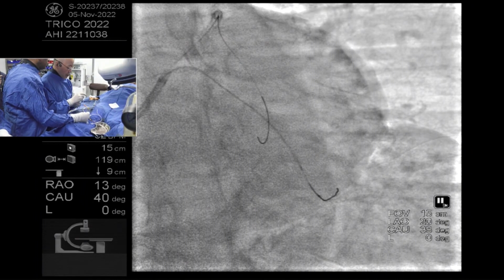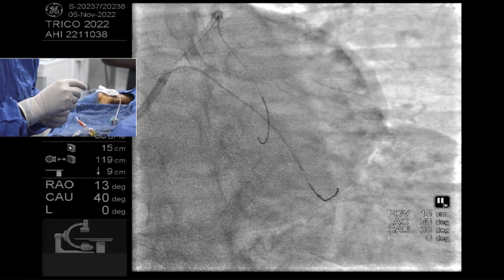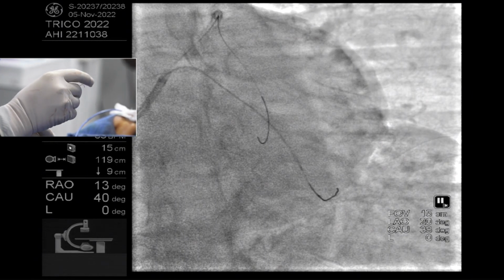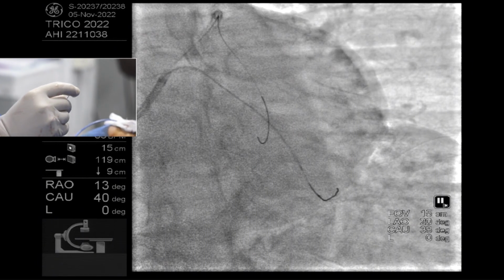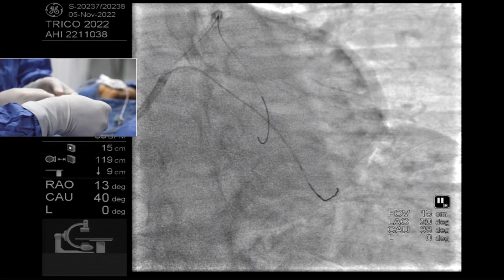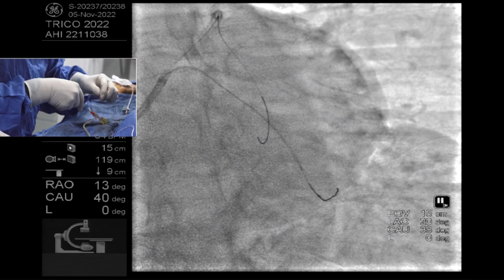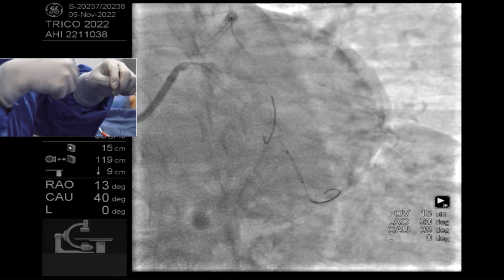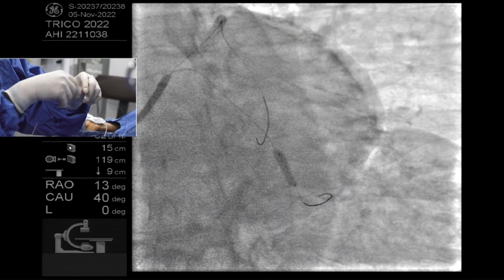I'm just asking, there are two parallel OMs and this is smaller compared to the OM we have stented. So can we leave it? It's always a good question. It's quite a tight lesion. I think the plan for Dr. Saito is to continue to try that. I think the condition of our patient will decide that. It's a pretty big territory OM though, OM1.